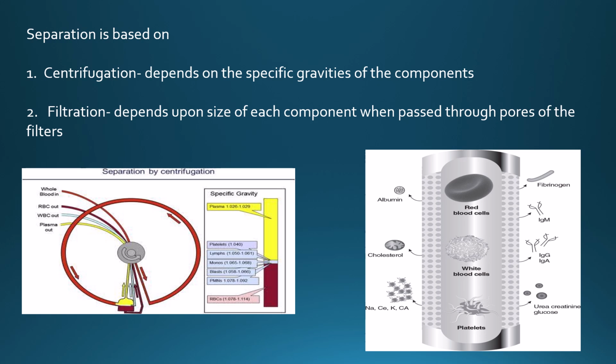In centrifugation, the blood is spun at a high speed. Different components settle into layers based on density. This allows us to selectively remove just the component we want. For example, in GBS, we want to remove the plasma, so we can remove the plasma. And for leukemia, white cells are removed.